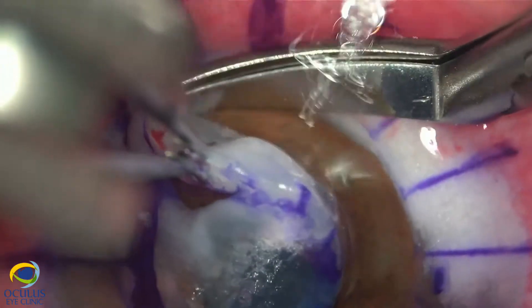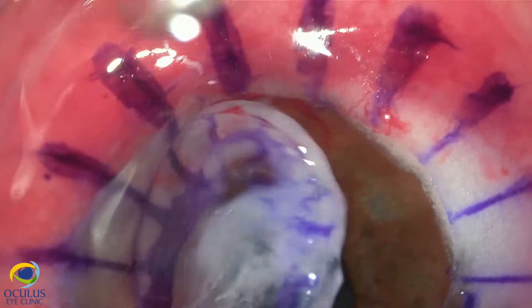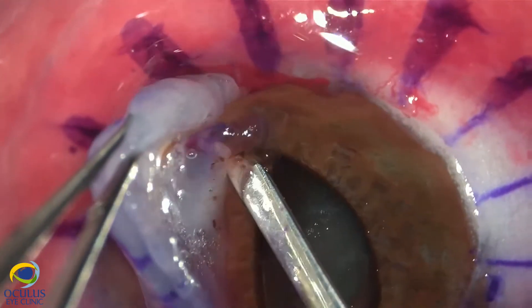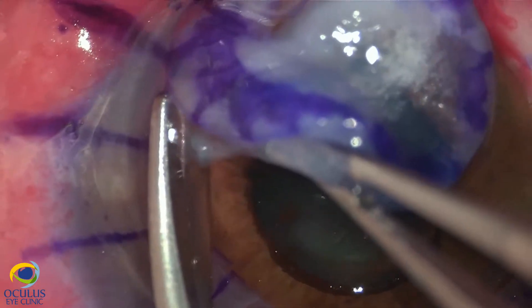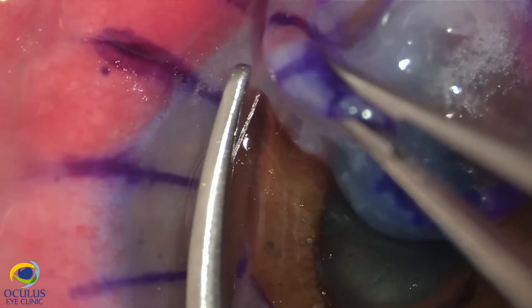We are very careful not to perforate the iris. In cases like this, we recommend using a fine spatula to very gently detach the iris from the cornea with slow, careful maneuvers, and we manage to do this successfully. We then continue on the other part of the cornea, again paying a lot of attention to avoid any iris damage.